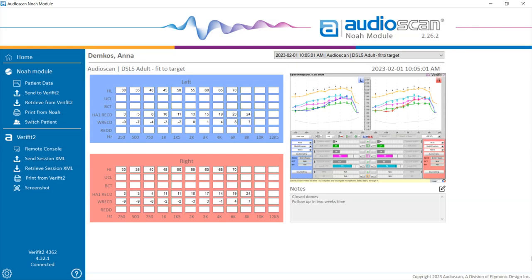The Audioscan Noah module is a PC application that runs within Noah 4 and allows AudioScan equipment to exchange data with the Noah 4 database and other Noah 4 modules.